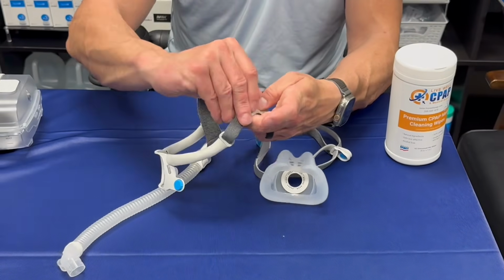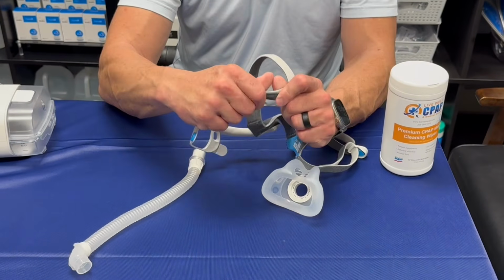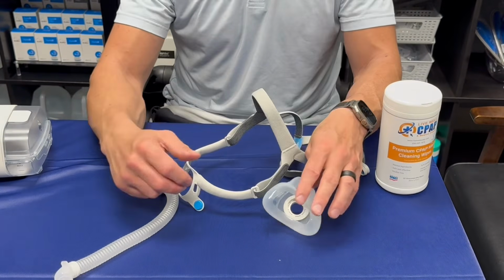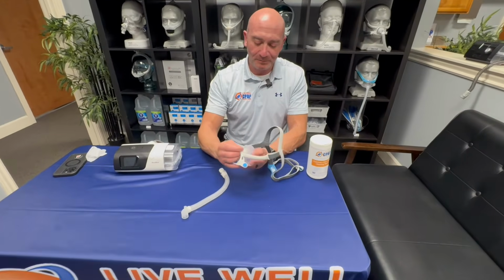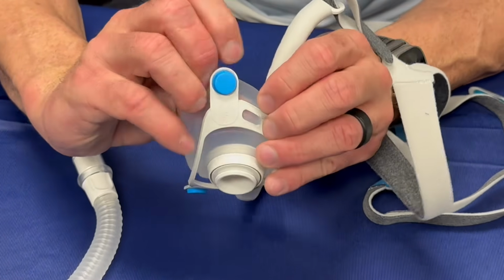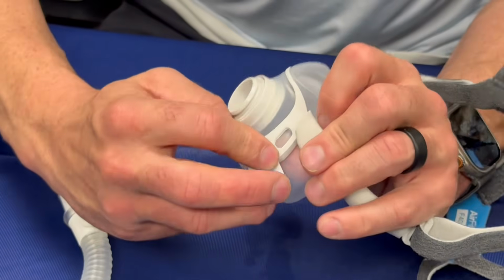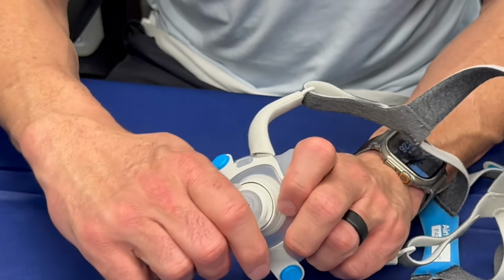And then you can take the headgear off here and pull it out. As far as cleaning goes, I kind of leave that there just so you don't have to readjust it, and then wash the frame separately from these 2 pieces if you are washing them. But it goes back together very, very simple. Just pushing these tabs up through the frame. And then again, just connecting that piece there.